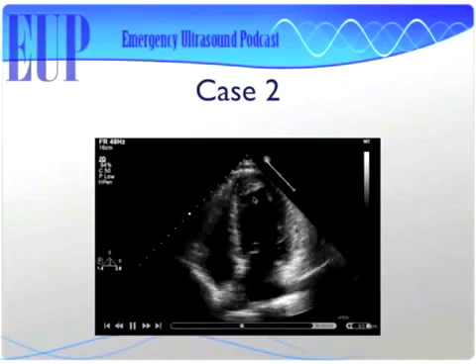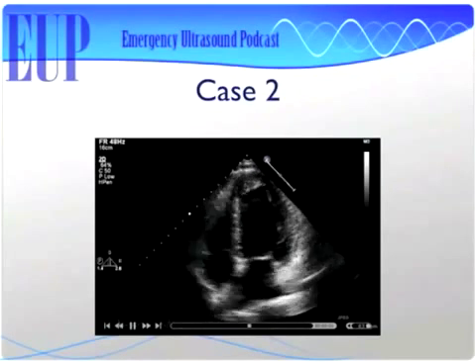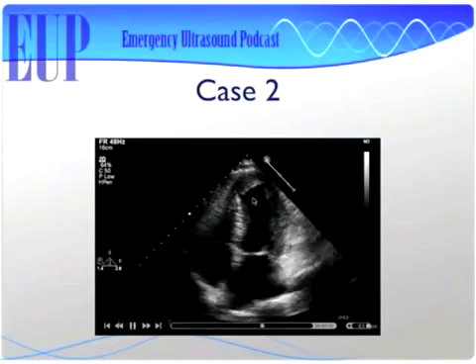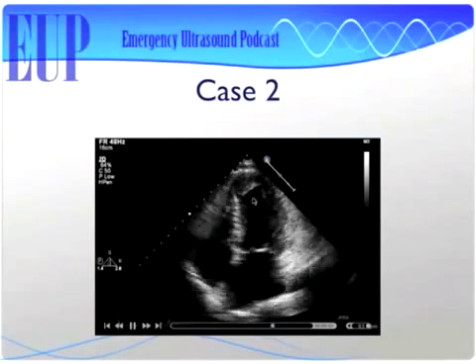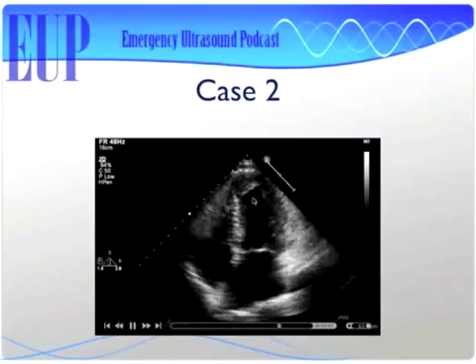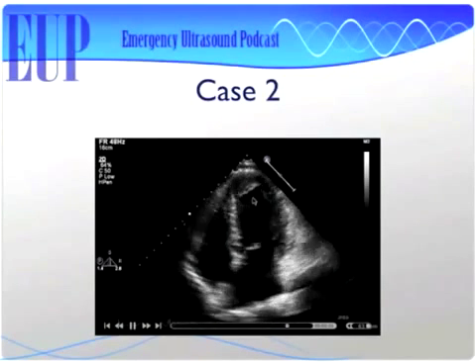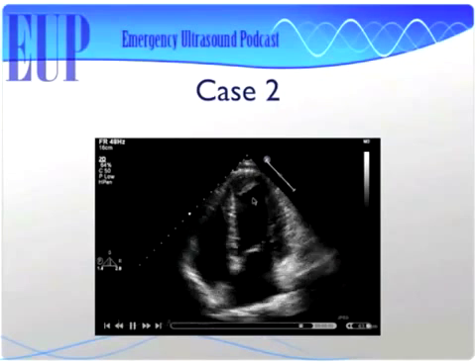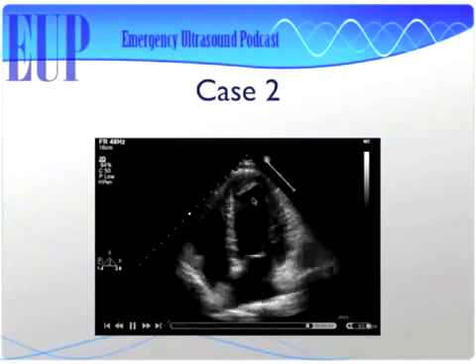I'd say maybe a clot. Yeah, so that's a funky clot chilling out in the LAD distribution. So what happens is when you get that part of your heart that's so dead, or the myocardium has been down for so long that there's not any squeeze, you actually get hardly any blood flow in that particular area, and the blood will just sit there and it'll clot off, and that's how people get apical thrombi. It's very, very rare to get an apical thrombus without some sort of coronary artery lesion.